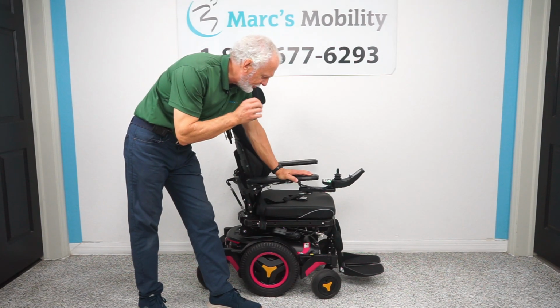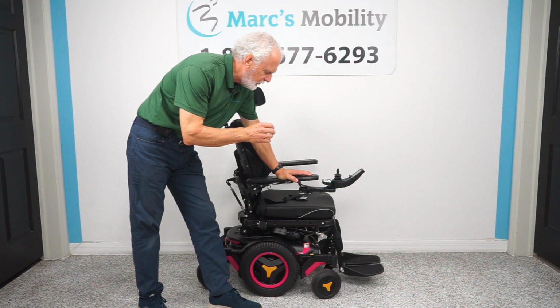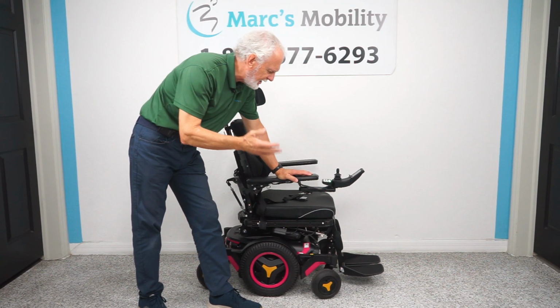We're doing a review today on a Permobil M3 with three functions: electric tilt, electric recline, and the electric feet.